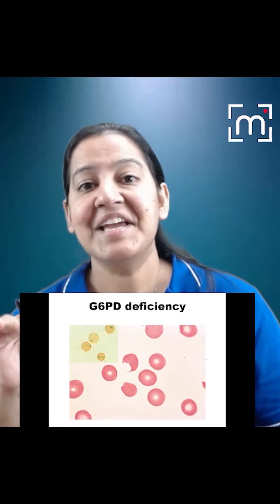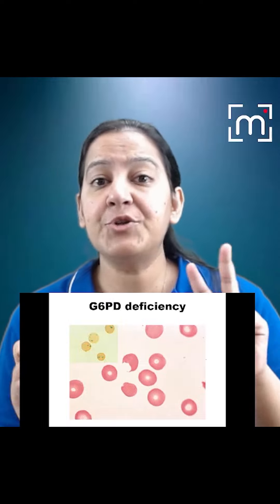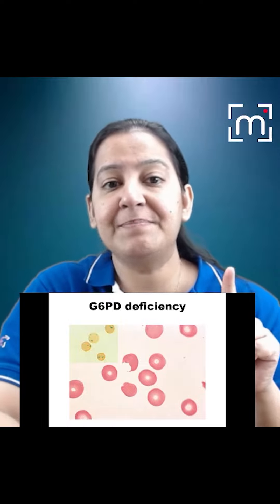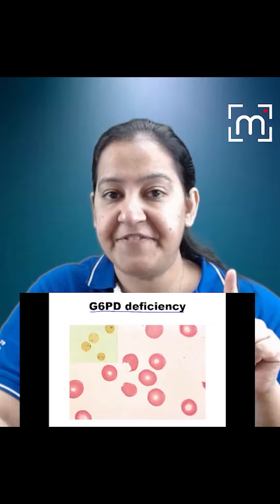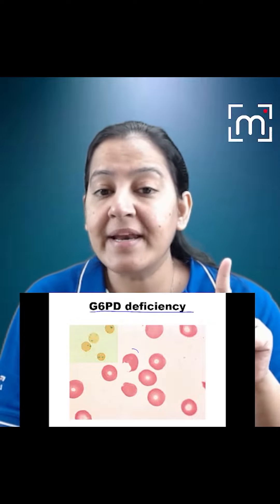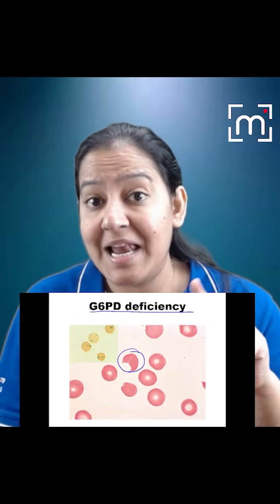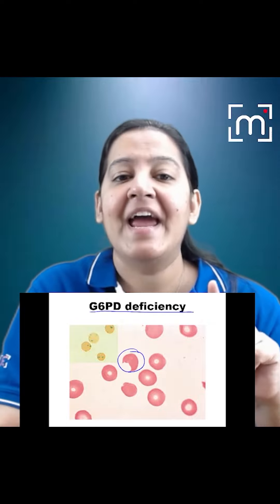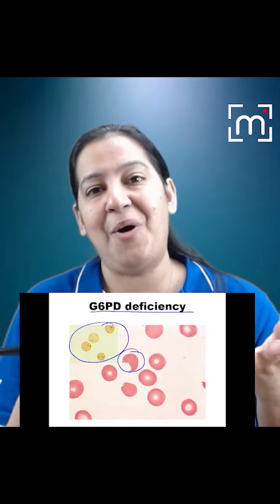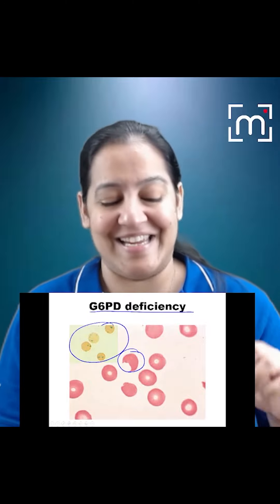Can you identify the two abnormalities shown in this peripheral smear of G6PD deficiency? Number 1 is the bite cell, and number 2 is Heinz bodies, which are seen on the supravital stain.